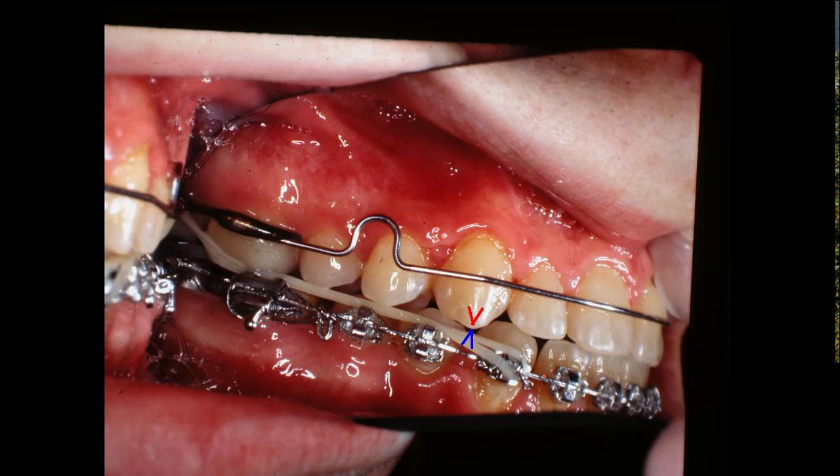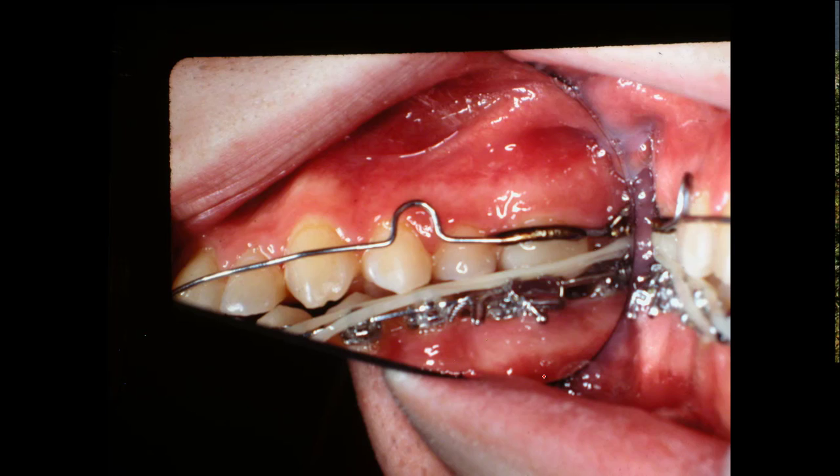Okay, this is at 1988. That's where we had him back to that point, you see. And we were wearing class 3 elastics. Now I fixed up the retainer where you see this acrylic pad right here. And he had to snap this retainer over that hump in the 6-year molar. Now we had a hook back here, and he is wearing this elastic off of that hook down to a hook on the cuspid, and I had a 4 to 4 bonded on the lower anteriors.